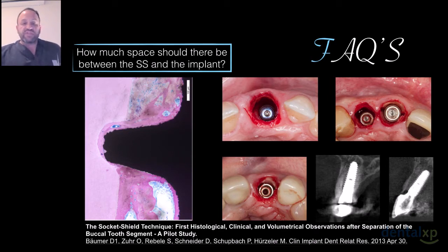Okay, and you can see the numerous cases that I'll show you over here, where I tend to keep it as far away as possible, and I'll follow the Cavani protocol very, very strictly as much as I can. But you can see on the upper right-hand side, we've got cases which are much closer where you don't really have too much space. You need an implant that's slightly wider. You need to use something that's going to go closer, and some are close, some are far.